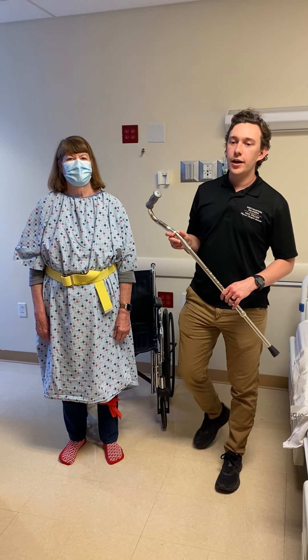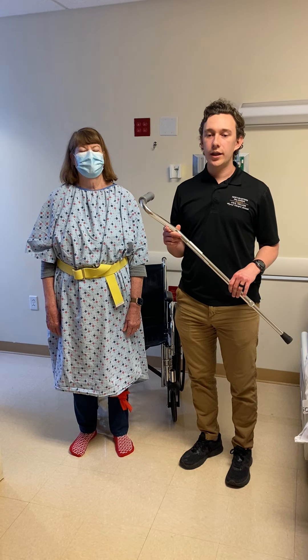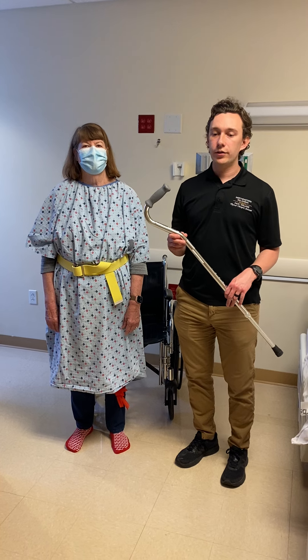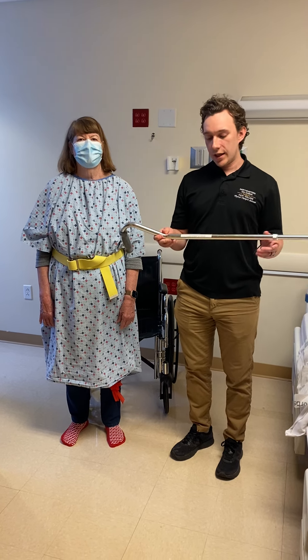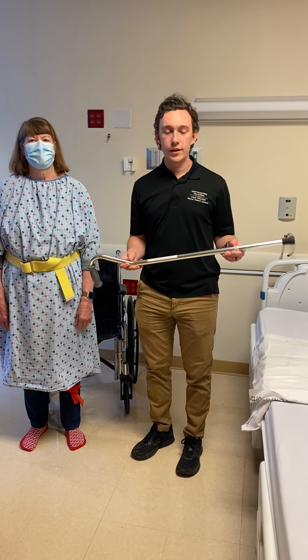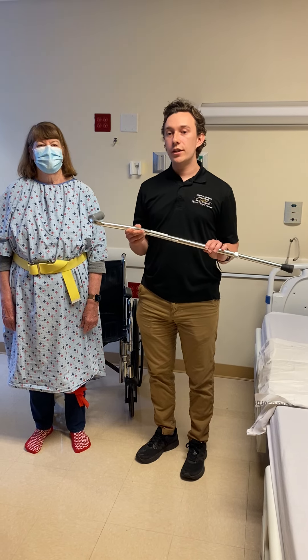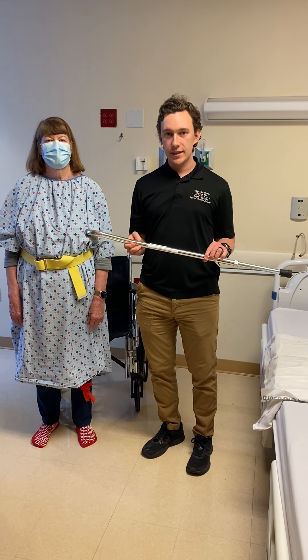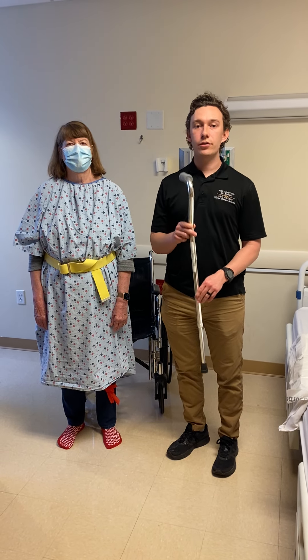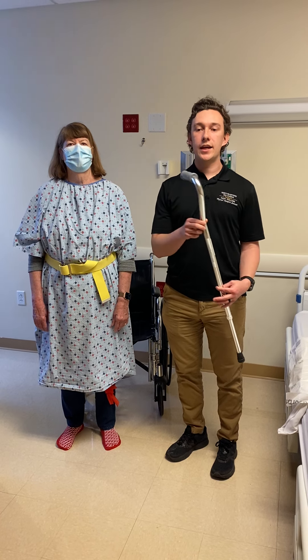We're going to be looking at principles with this cane and gait patterns with the cane with our patient. This is a single point cane, and you can also use the same principles with a quad cane as well. A single point cane has one point at the end. The primary use for this assistive device is for balance. The patient should not be applying a whole lot of pressure through this device, as it is not as stable as a walker.